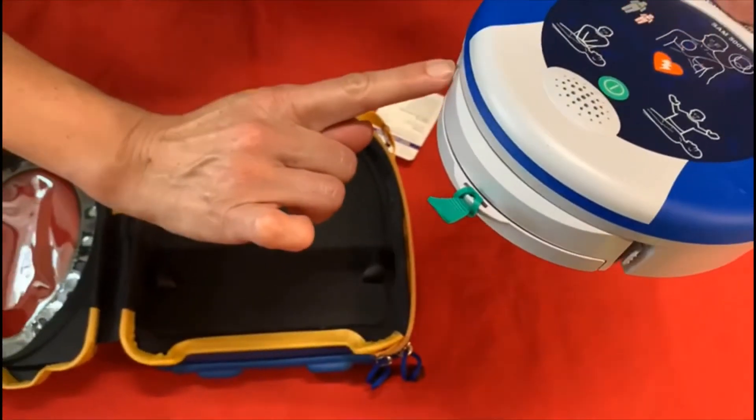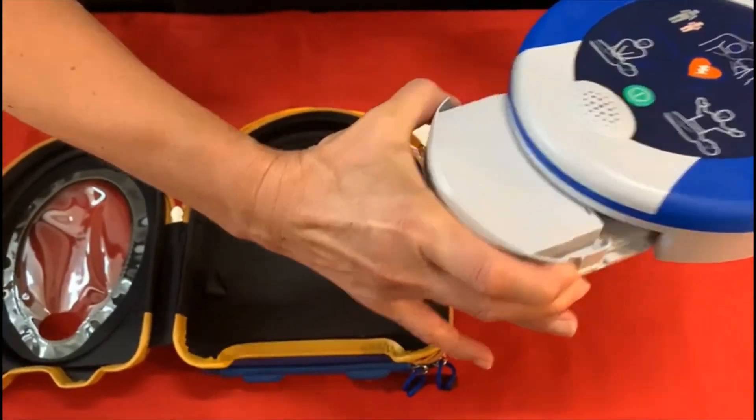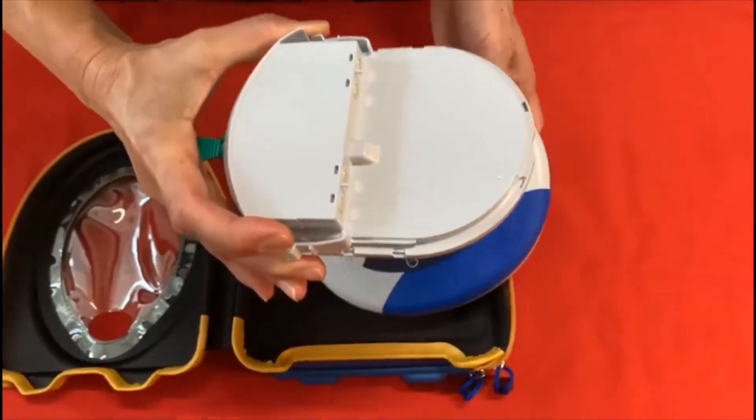One little clip, other clip on the other side. Simply hold those in and your cartridge will come out. We're going to get the new cartridge.